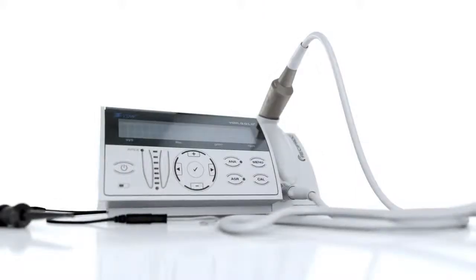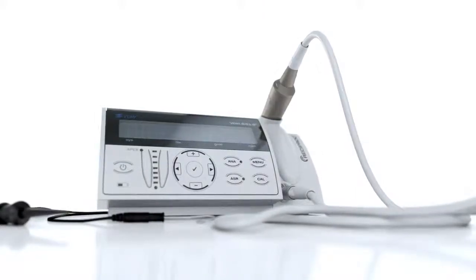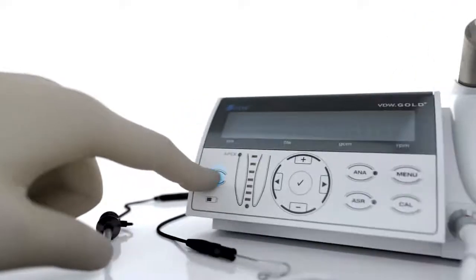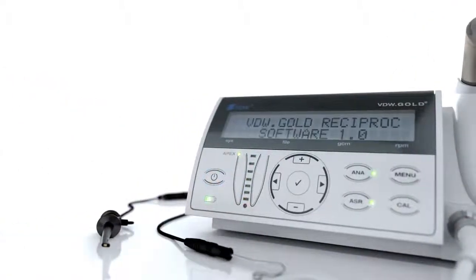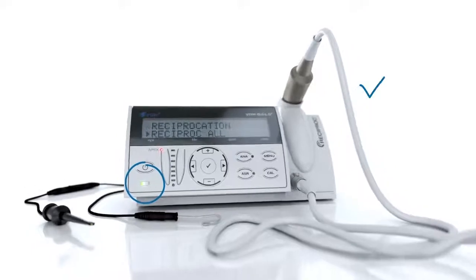To start your VDW Gold Reciproc, press the power key. You can find this key above the battery icon. When the battery symbol lights green, the motor is ready for use.